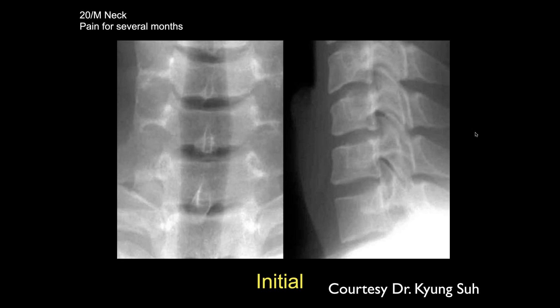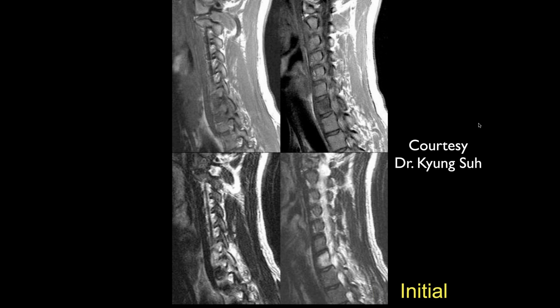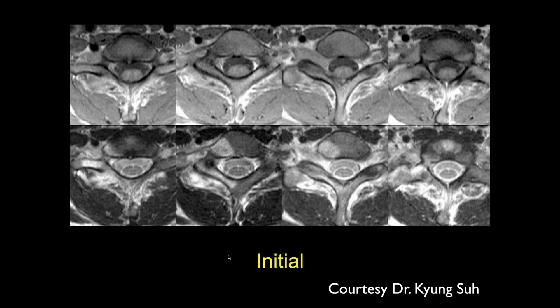Ashu, what do you think of this one? Looking at the plain films, I'm not really seeing too much here. These are the initial ones, AP and lateral. Here's the initial MR. So here you can see some marrow-replacing lesion within the lower cervical vertebral body, extending posteriorly to involve part of the posterior elements — increased T2 signal, low T1. And it looks like it's going into the facet. You can see it's definitely involving that posterior right vertebral body and extending into the medial aspect.